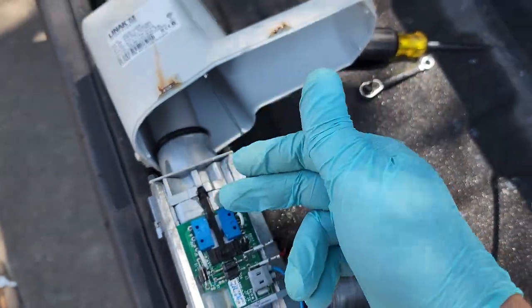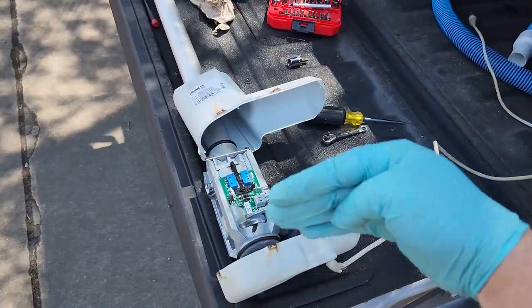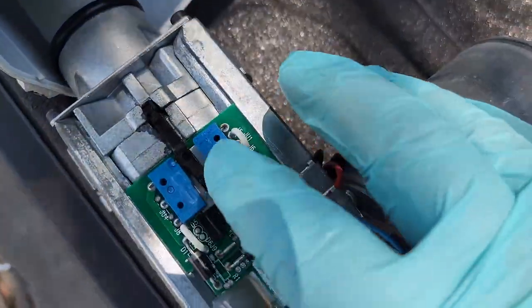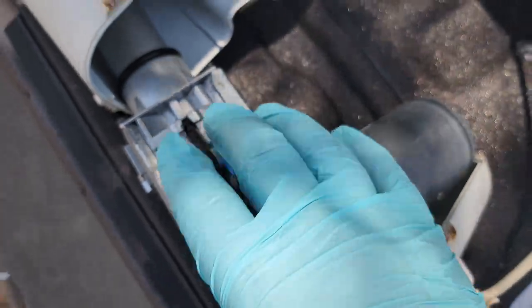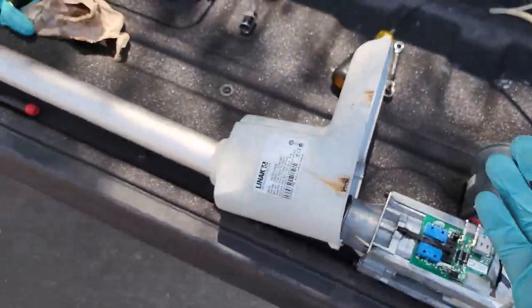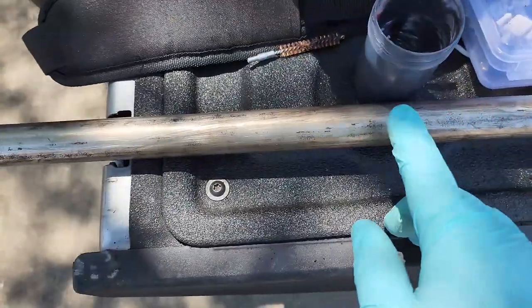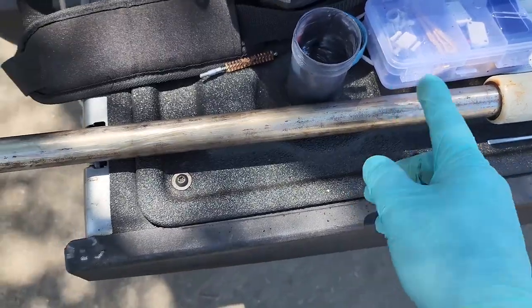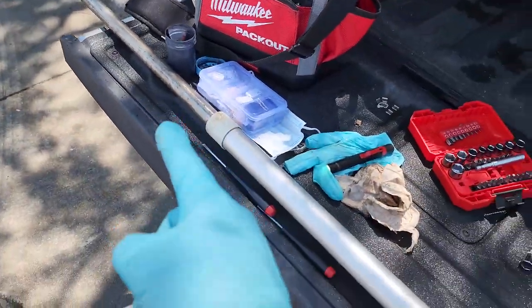So now it does move, and now I just have to take it inside, hook it up, and make sure that it does detect top and bottom. So these two micro switches work. That's your up detect and low detect. And so far it looks like it's good. I was able to clean up a lot of the stuff that was on here using metal scrapers. You can see that there's still some remnants. It's never going to be back to normal. There is some light pitting on there.